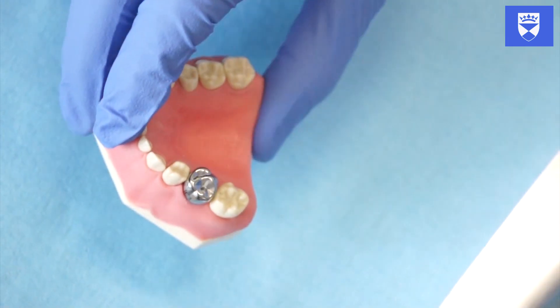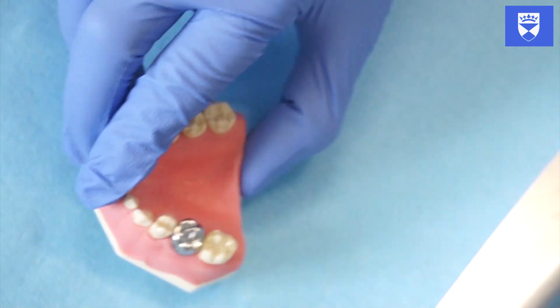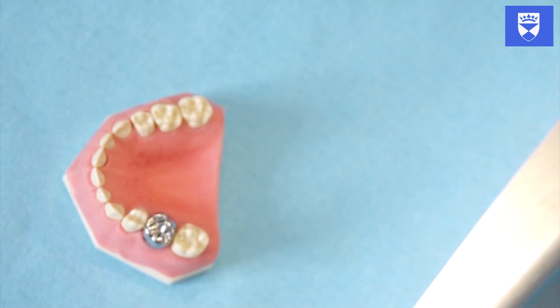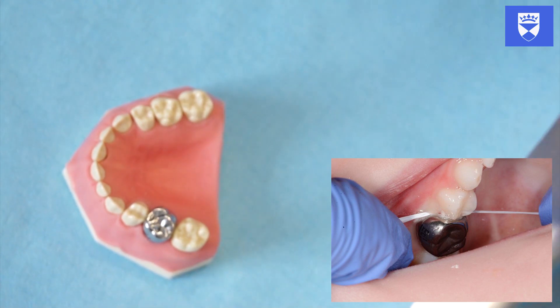Using a periodontal probe, ensure that no excess cement is present in the gingival sulcus. Gently floss the contact points to ensure that they are clear of cement.